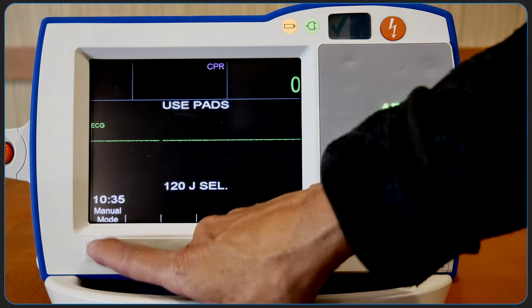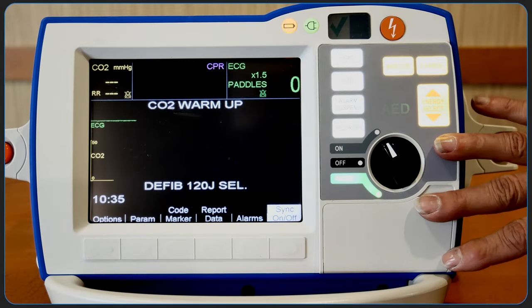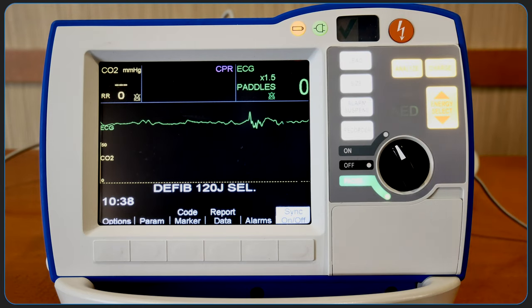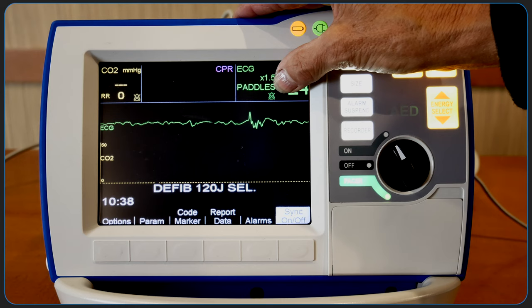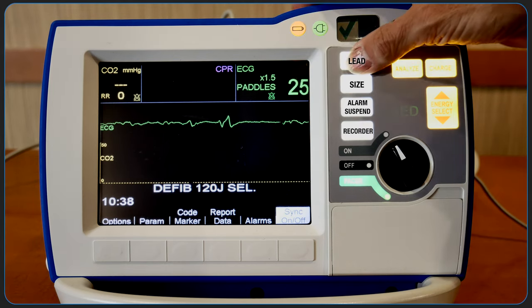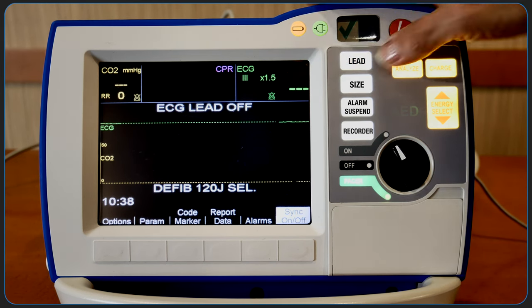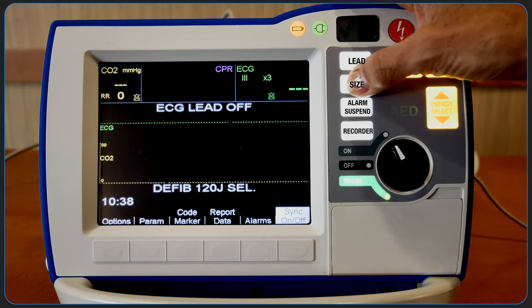To switch to manual mode, press the manual mode soft key on the front panel. The display screen has a color-coded layout. End-tidal carbon dioxide values and waveform are shown here, and ECG parameters are shown here. The pads or paddles lead setting is automatically selected when the defibrillator is turned to manual mode, depending on whether the cable is attached to the electrodes or pads. The lead button can be used to select the ECG source for display and printing, and the size button can be used to select the amplitude scale factor for the ECG waveform.